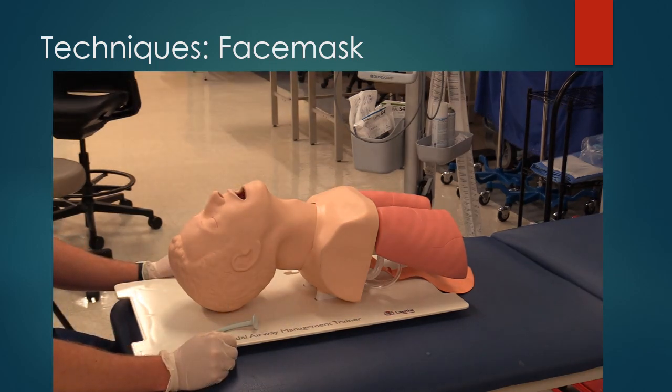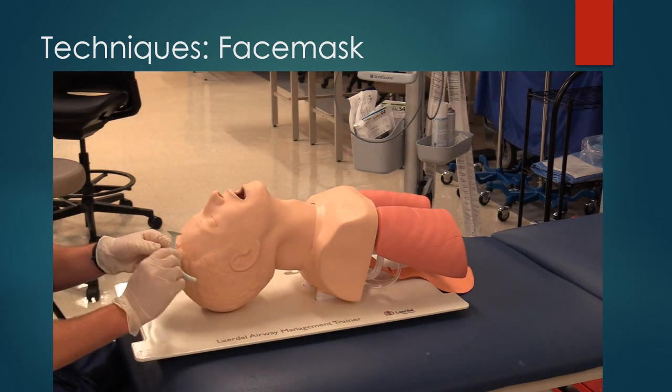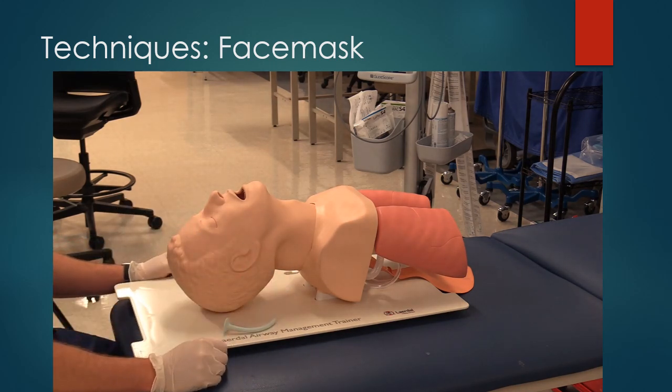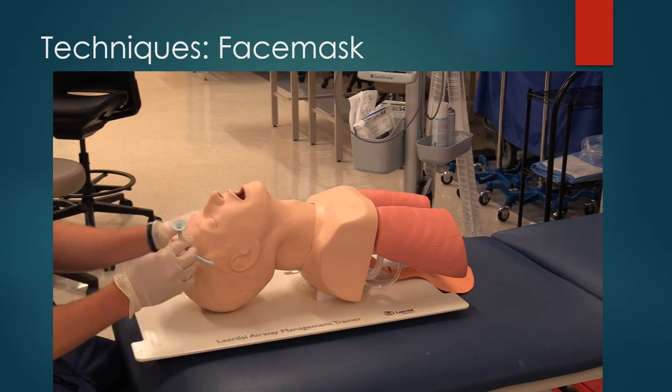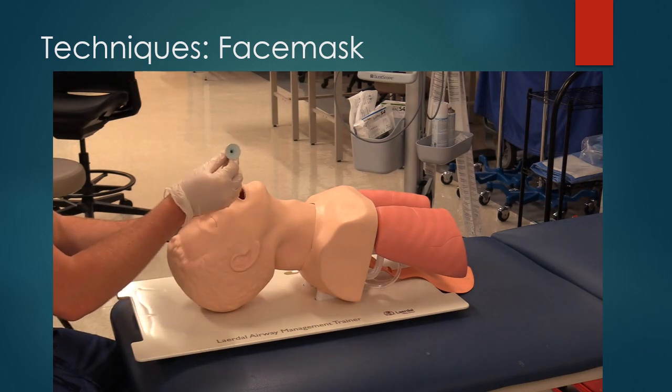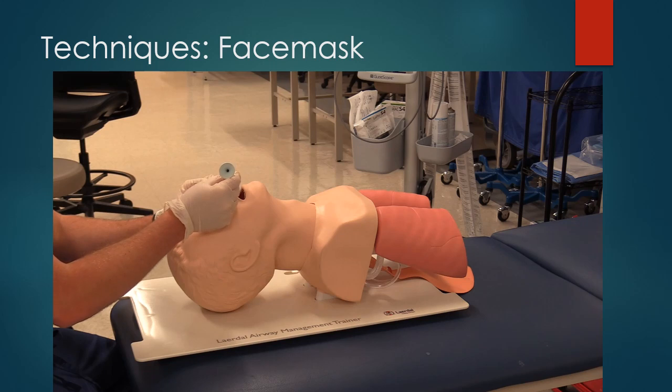If an oral airway is not working well enough, another option is a nasal trumpet or nasopharyngeal airway. This again comes in multiple sizes, this time sizing being from the nares to the tragus. Once you have the proper size, with a little bit of lube on the nasal trumpet, gently insert into one nares, spinning as you go. If you feel resistance, try the other side, as most people will have one nasal passage that is slightly larger than the other.